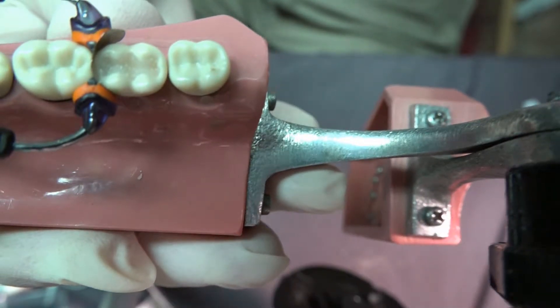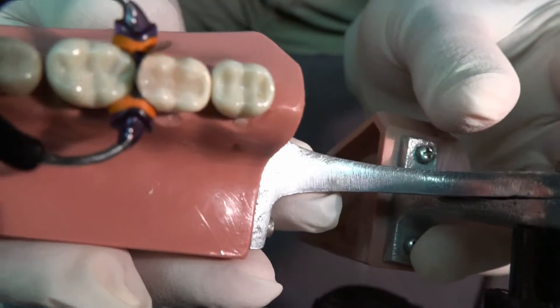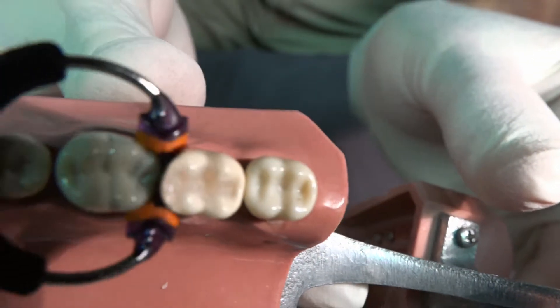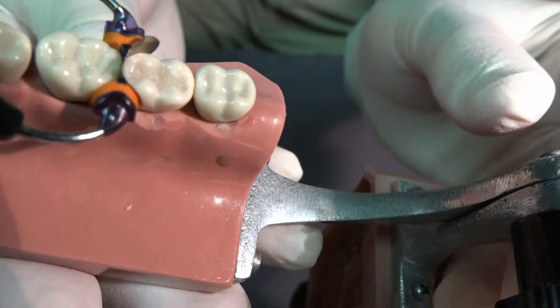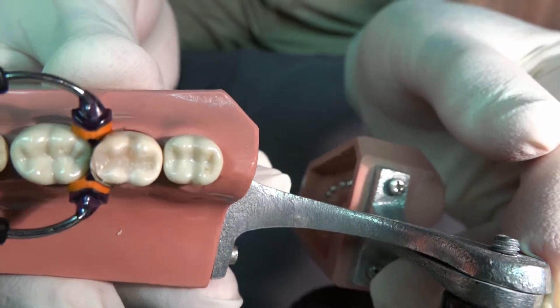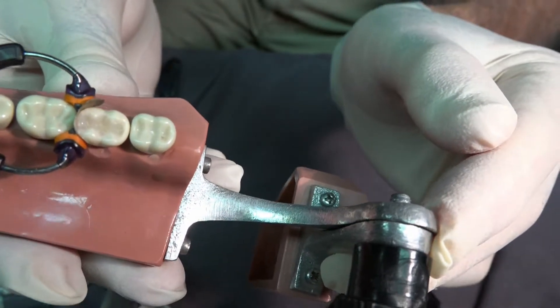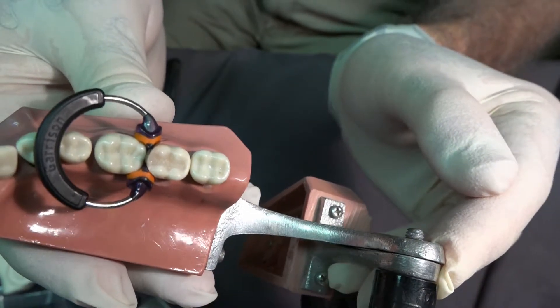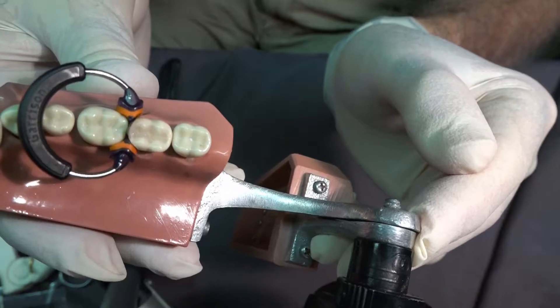Imagine if your composite looked like this after curing. You will save five to ten minutes of chair time on every composite that you place by using this technique. Can you imagine, after curing a composite, your composite being as smooth and as well contoured as this one is?